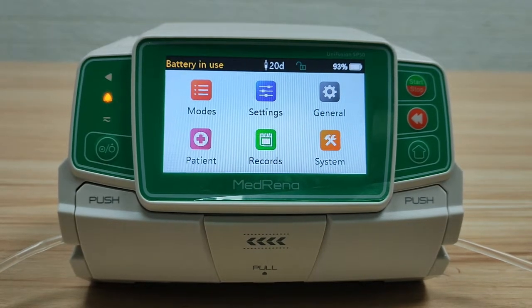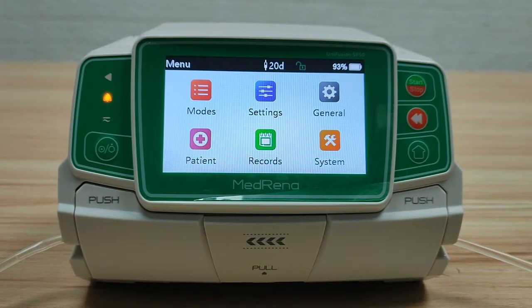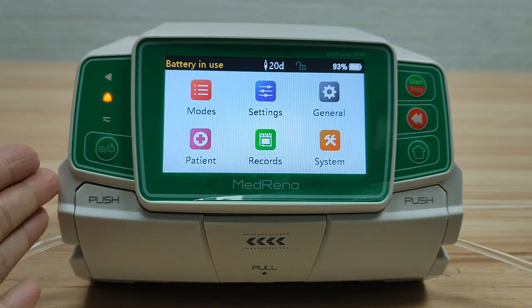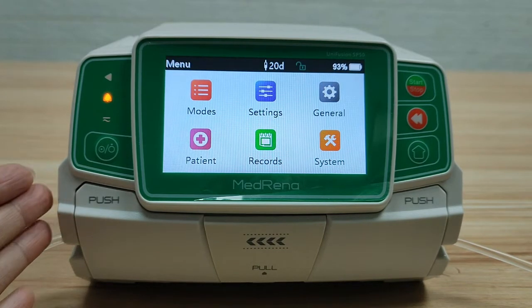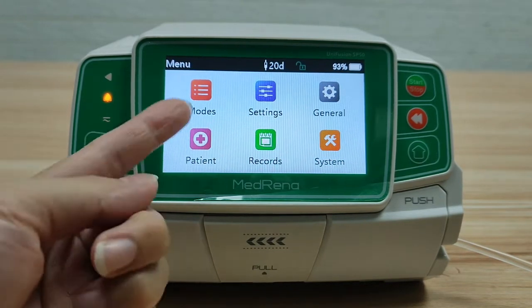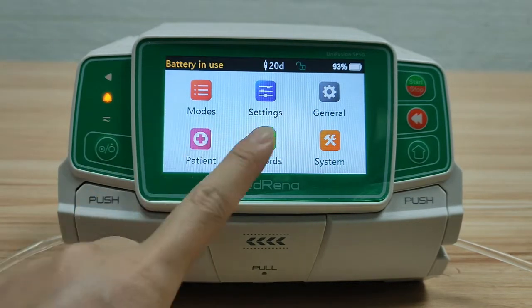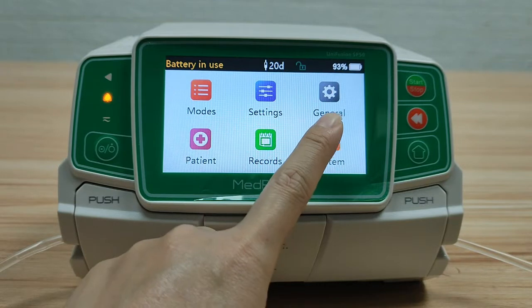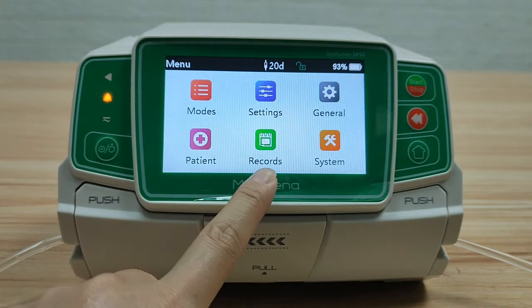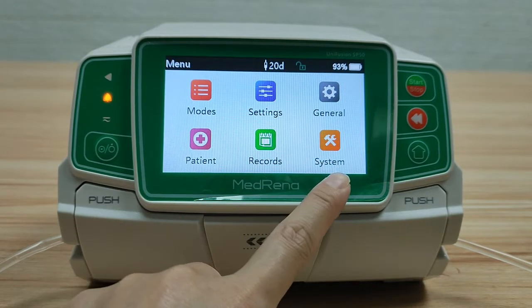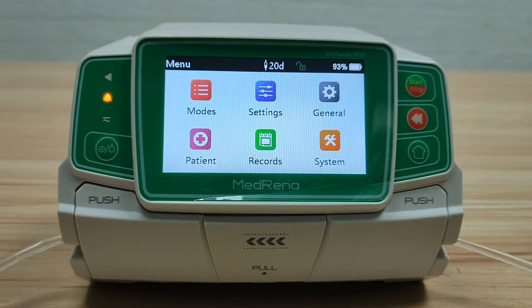This video introduces the various settings of the MedRena infusion pump, model name Unifusion VP50. This is the home page. There are six boxes on the screen: Modes, Settings, General, Patient, Records, and System. In the last video we introduced Modes.